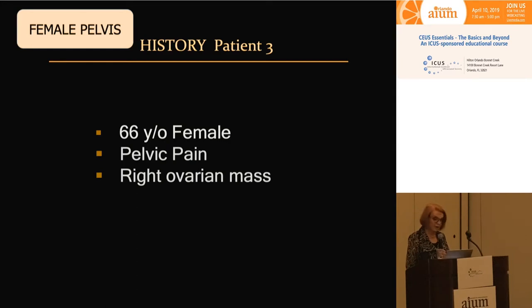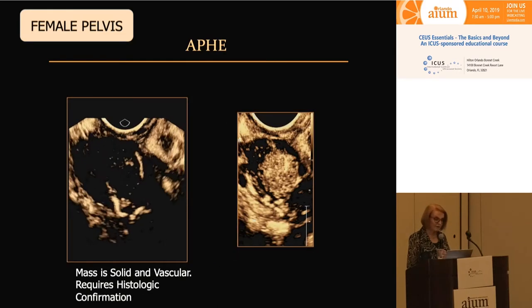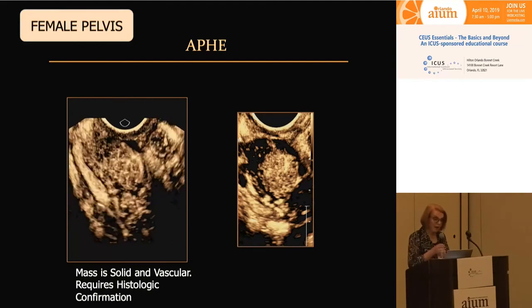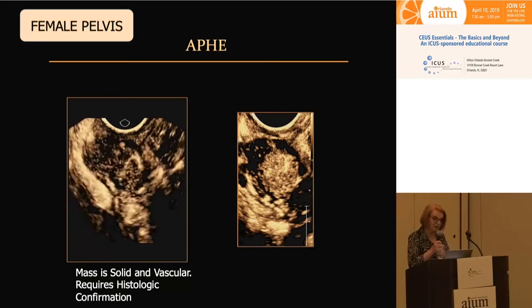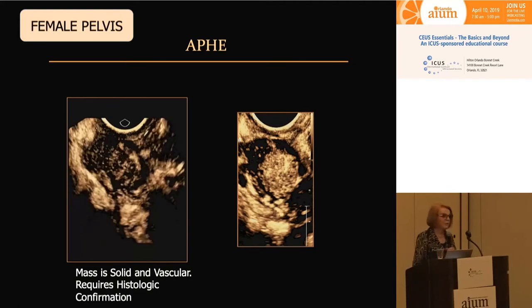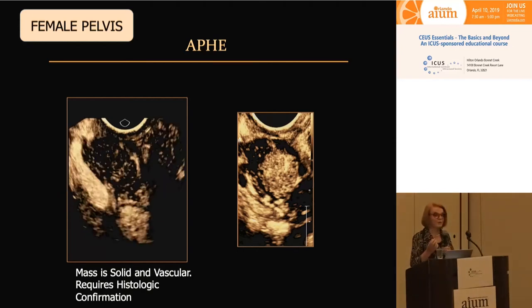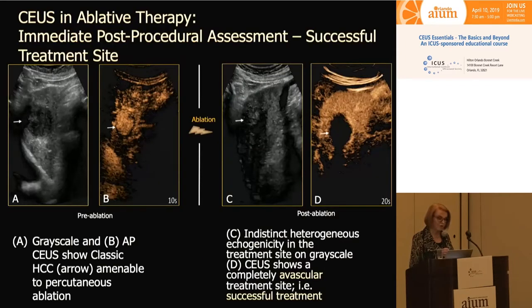Contrast that with another patient with pelvic pain and a right ovarian mass. We can see the ovary, and inside there's a focal mass lesion within a bulky ovary. On contrast-enhanced injection, this is a hyper-enhancing nodule — subject to biopsy — and this is a granulosa cell tumor in the ovary. When we consider what we're doing with MR and CT for ovarian masses, we're trying to show hypervascular foci. Here's washout of this mass at one minute, with even more washout at two minutes.